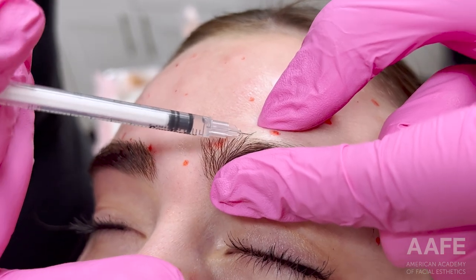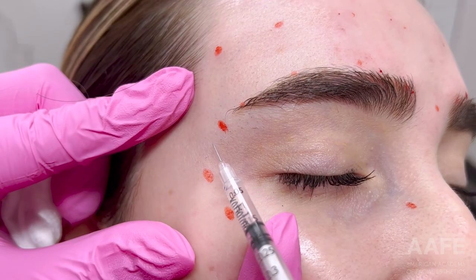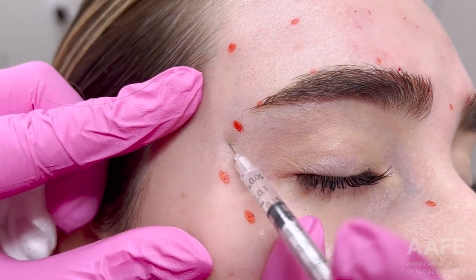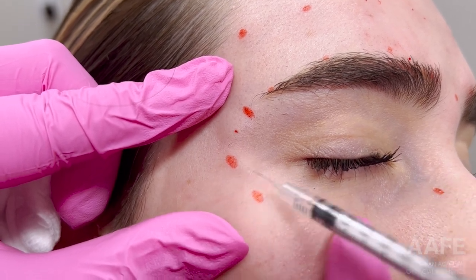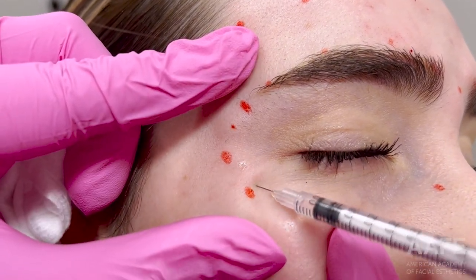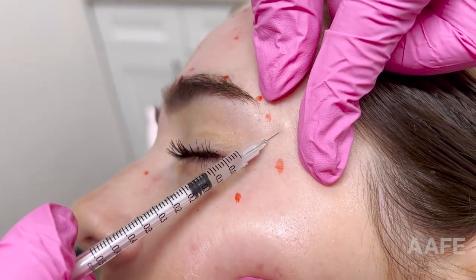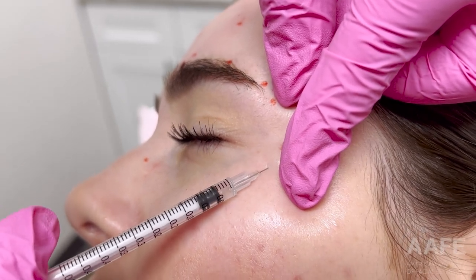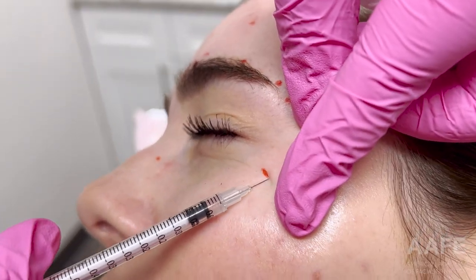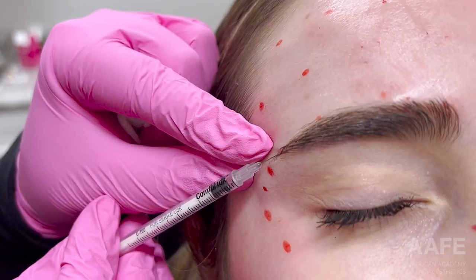Sealing off the orbital rim ensures the neurotoxin stays in the corrugator muscle and doesn't leak down to the lid and give her lid ptosis. Elizabeth is actually getting married in a little over a month, so this is basically her Botox about six weeks before her wedding to ensure it is perfect and set in and ready to go. Talk about pressure — getting to inject an employee and a friend who is getting married in six weeks.